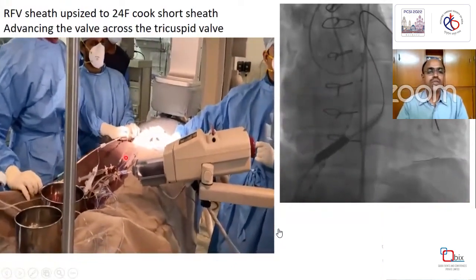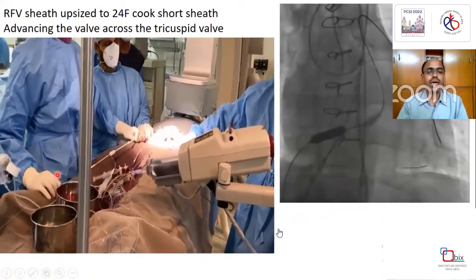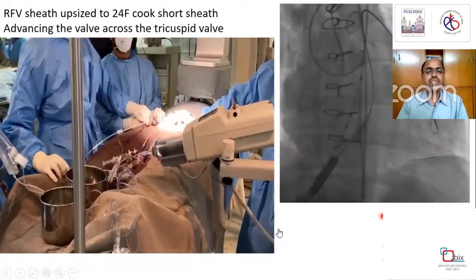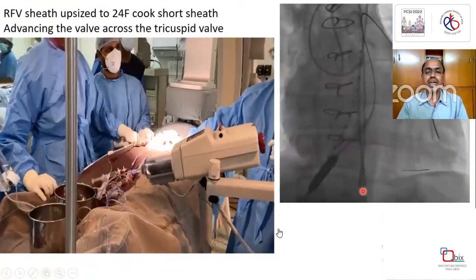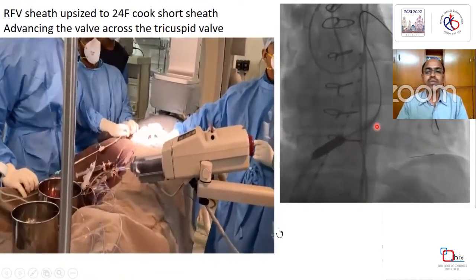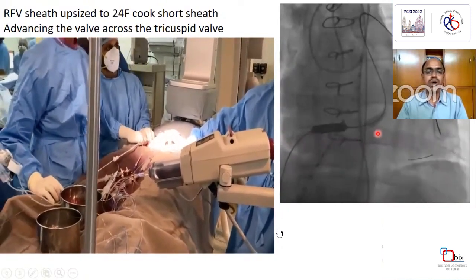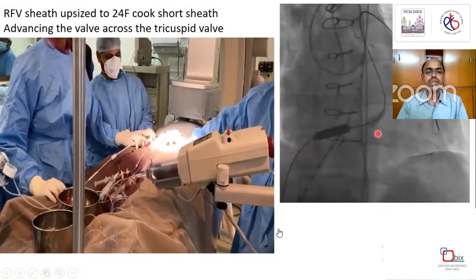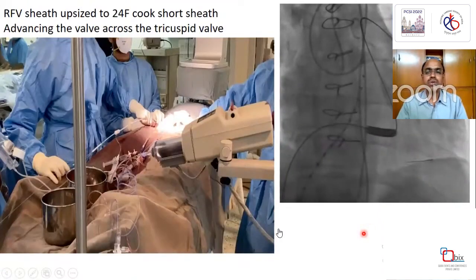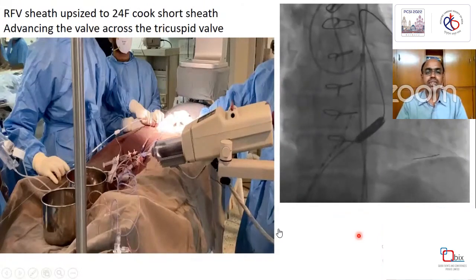We slowly advance with control over the guide wire with one hand, and as soon as it reached the region of the right ventricular outflow tract, there was a brief difficulty in getting the valve turned towards the conduit. So a small jerky movement was made in order to promote the movement of the conduit towards the right ventricular outflow tract.